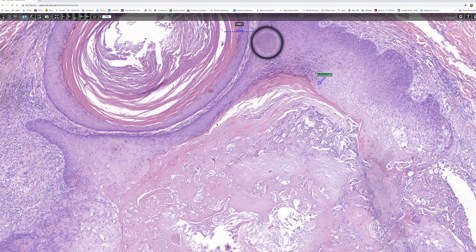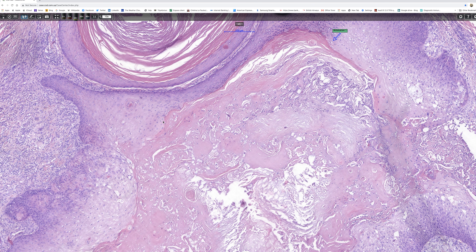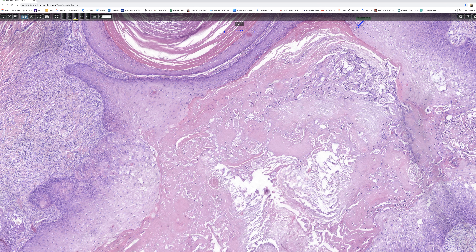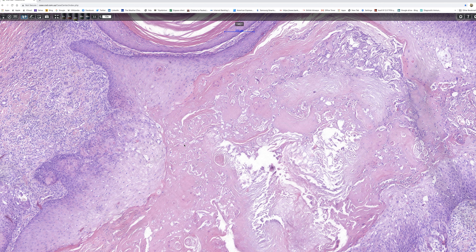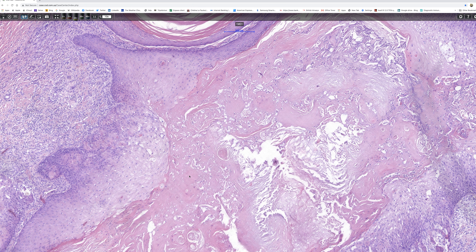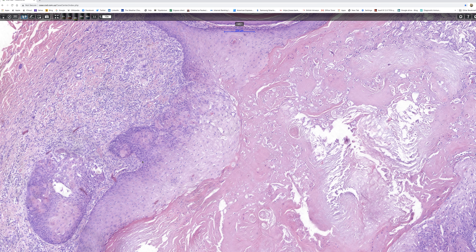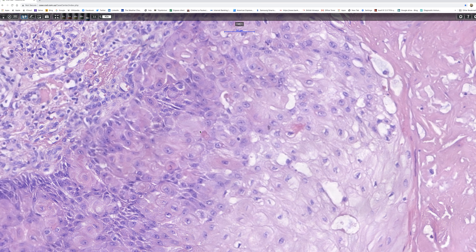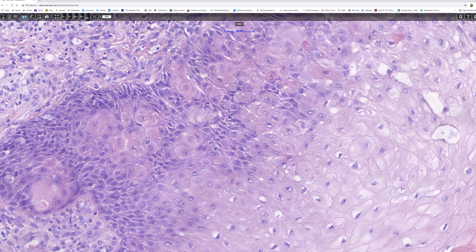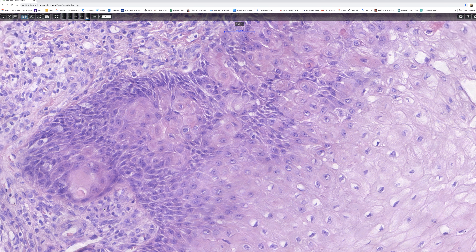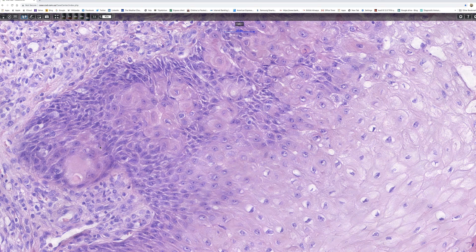But then when we look at the rest of the lesion, the wall is very definitely not typical epidermoid cyst. It's composed of stratified squamous epithelium, and in places the basaloid component predominates. And in fact, here we see nice squamous eddies, which are often a feature of this particular lesion.